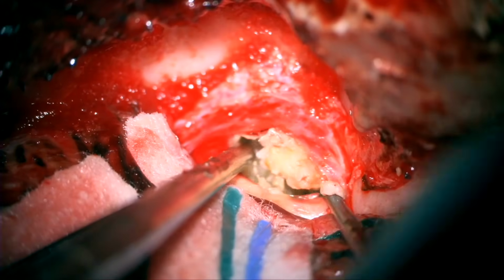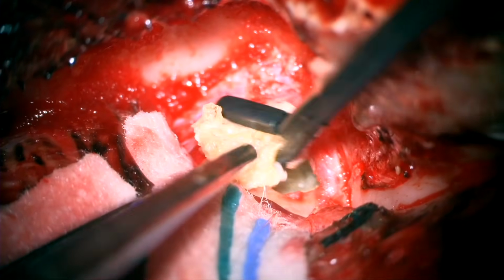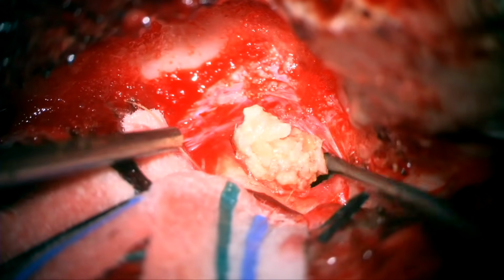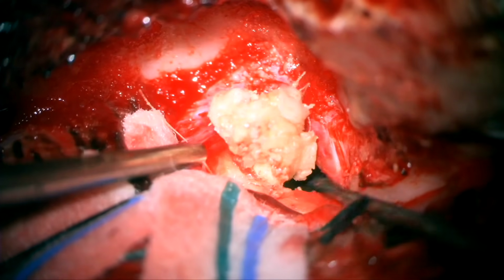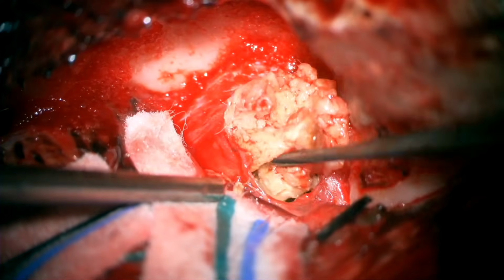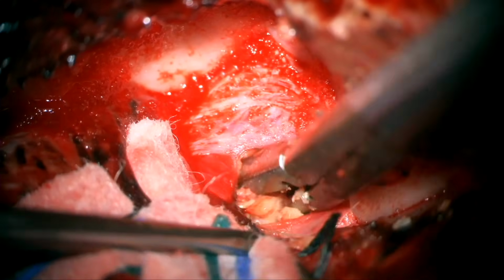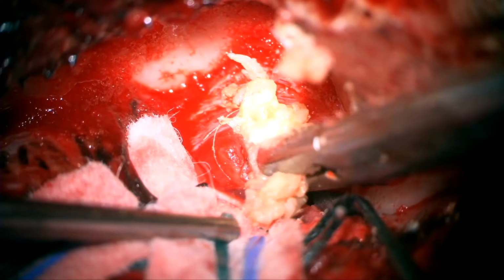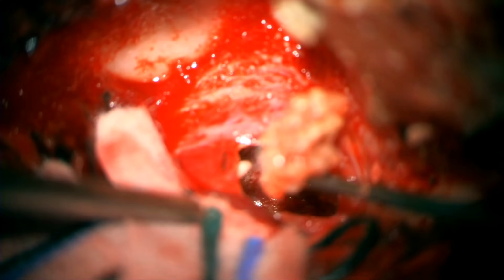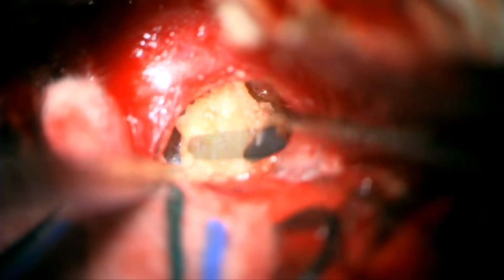At this point the operation just consists of gradual debulking, being careful with the surrounding cranial nerves, remembering that cranial nerve 3 is located superiorly and V1, V2 are displaced inferiorly. This case was done at Stanford Children's Hospital, along with Professor Gerald Grant. We believe in combining expertise with the pediatric neurosurgeons when we have skull base cases to achieve the best possible outcome.